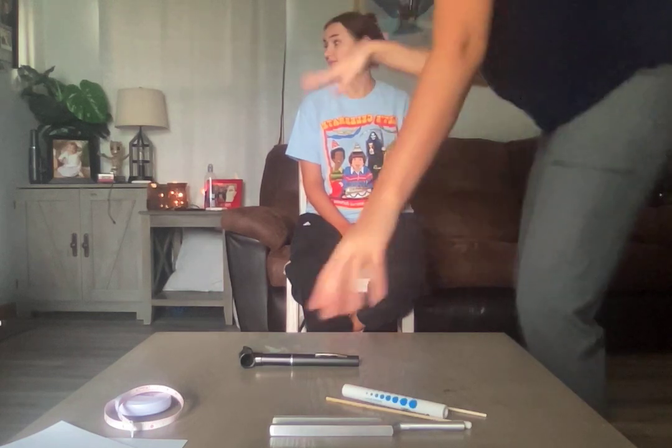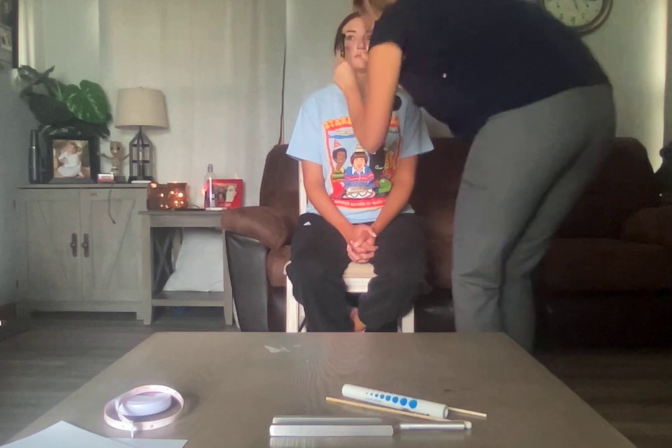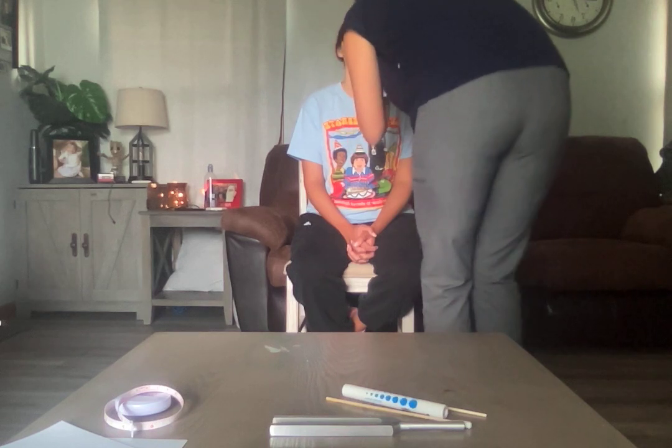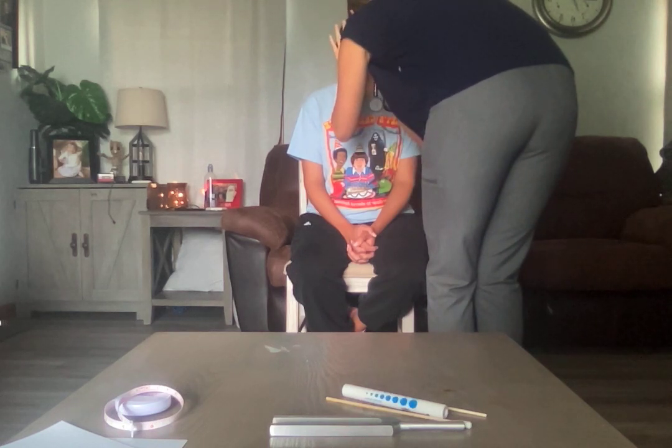All right, next I'm going to take a deeper look into the eye. I would dim the lights at this point. And first I'm going to do one eye at a time. I'm going to check for red reflex, look at the macula, and look for any abnormalities of the eye. Bright light in each eye. And then we're going to do the other eye. All right. Wonderful.